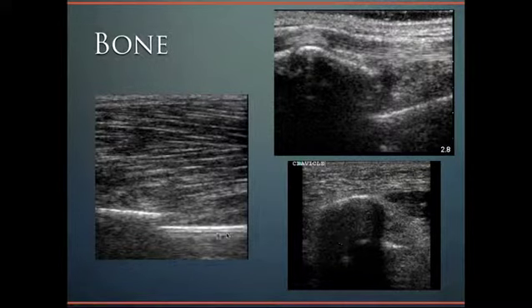When the bone has a fracture in it, we can see a step-off. So here's one bony fragment here, a step-off, and then another bony fragment here. We can see this up here as well. Here's a bony fragment coming along, step-off, and then another bony fragment going this way. In this particular patient, we can also make out the anisotropy seen on this area right here of its tendon, appearing falsely hypoechoic compared to this tendon portion and this tendon portion here. We would expect the tendon to continue to be hyperechoic, however, because of anisotropy, we see it's hypoechoic here.